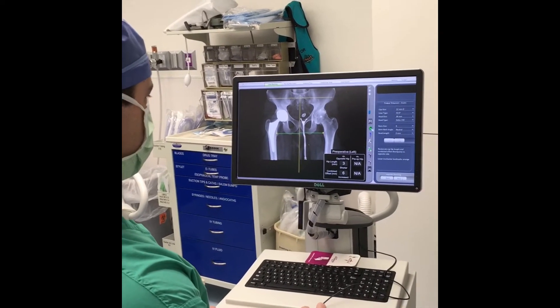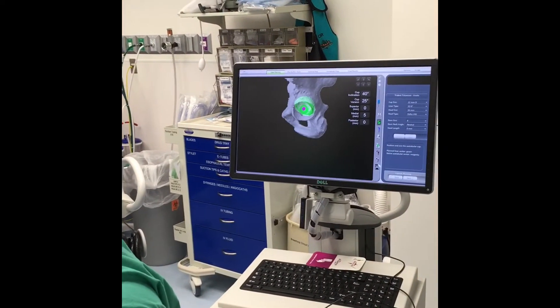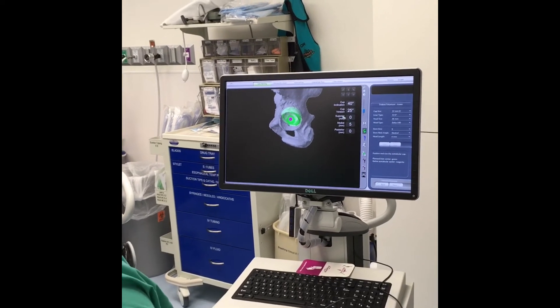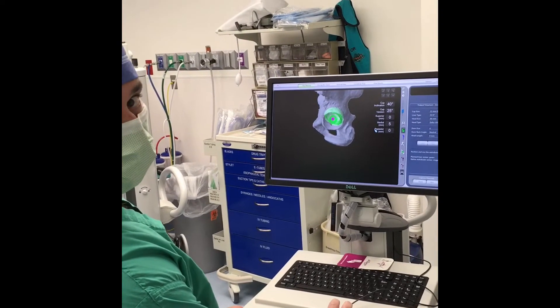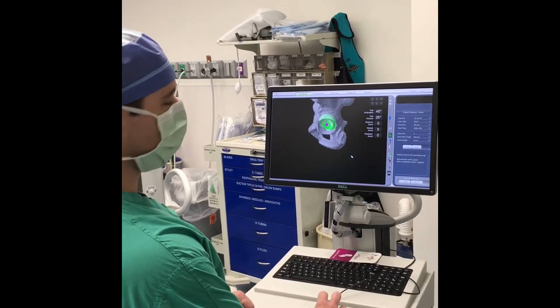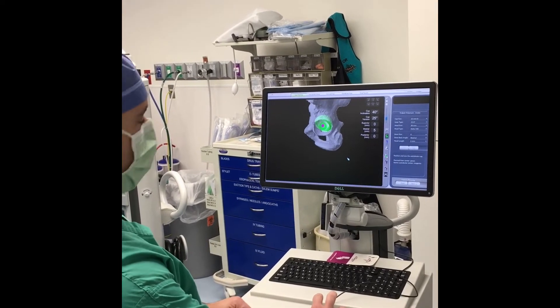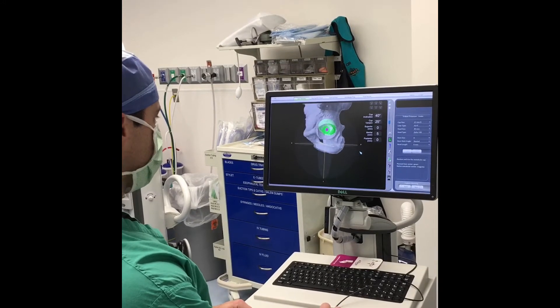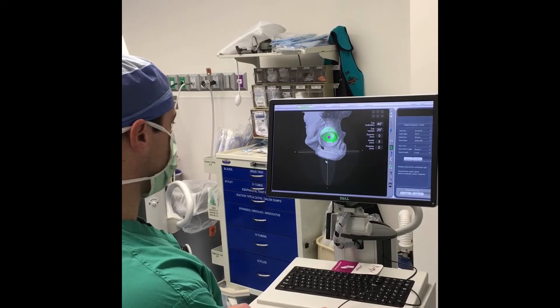Initially we start with the planning of the socket. We're looking at a cup inclination or abduction angle of about 40 degrees and cup anteversion of somewhere in the 20 to 25 degree range. We know from multiple published studies that these positions help ensure a durable result of the replacement and that they reduce the patient's risk of dislocation.